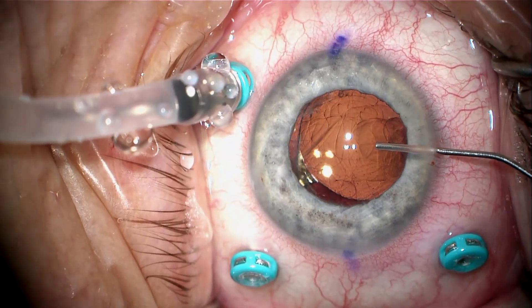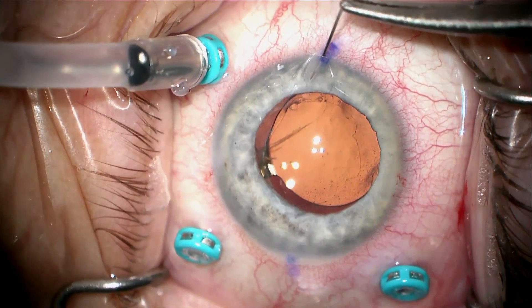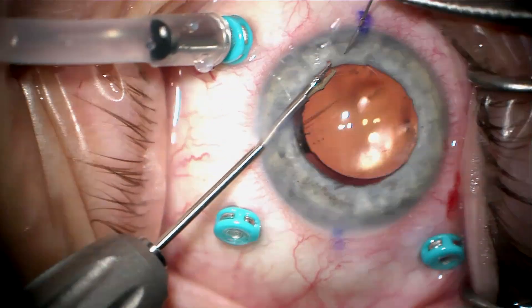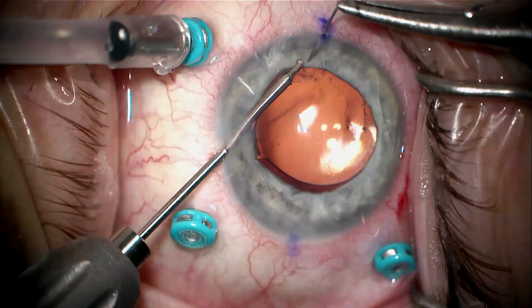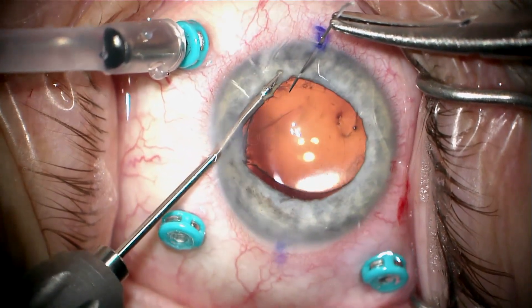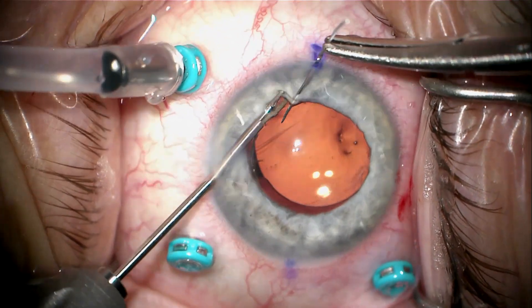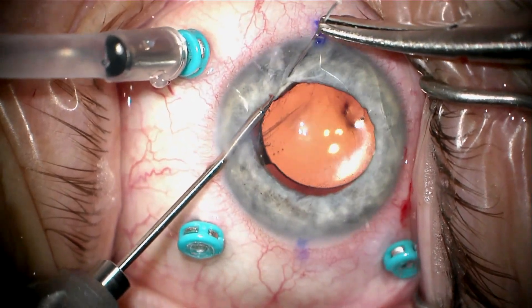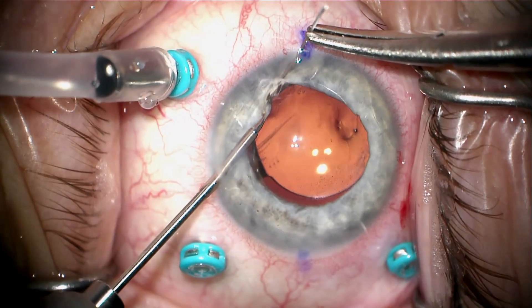We're injecting viscoelastic into the anterior chamber and proceeding with a pupil cerclage. This uses 10-0 prolene on a CIF-4 needle. I come in with my right hand through a paracentesis and use my left hand with a micrograsper through another paracentesis to wrap the iris around the tip of the needle.